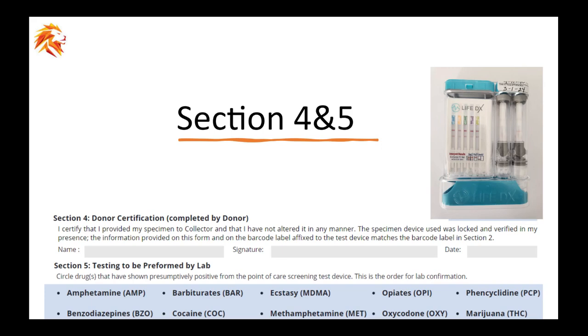The second sticker you will place on the chain of custody form in the big blue box near Sections 2 and 3. If the kit is not going to be shipped to the lab, the sticker should not be adhered to the kit, for privacy reasons when the kit is dropped in the trash. Be sure to put the labeled kit and the chain of custody form inside the biohazard bag together. This allows you to send more than one kit per package.